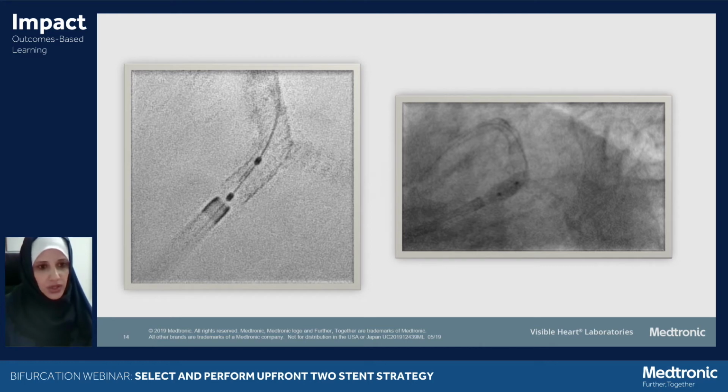If not, then you want your stent to be going all the way to the ostium, so you can hang a balloon, for example, if what you have on the shelf is 4.5 by 15, and hang it a little bit into the aorta, but just so that you preserve your carina and you make sure you're actually doing your post-dilatation appropriately.